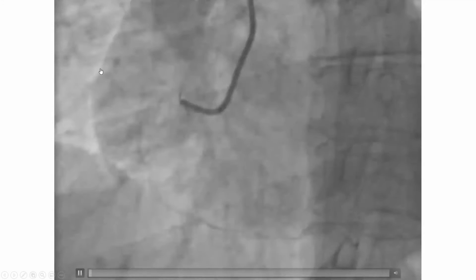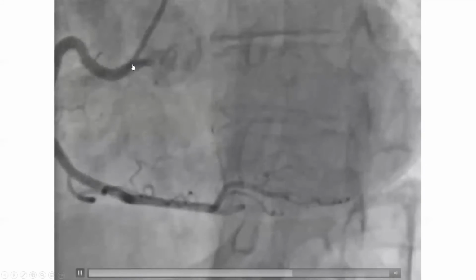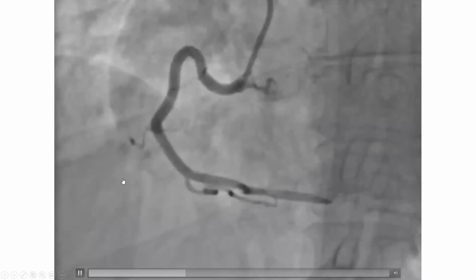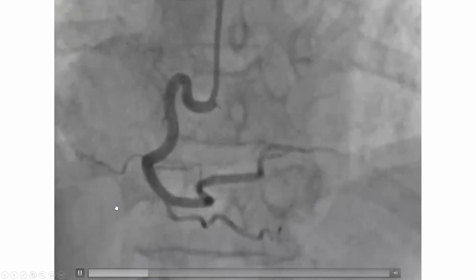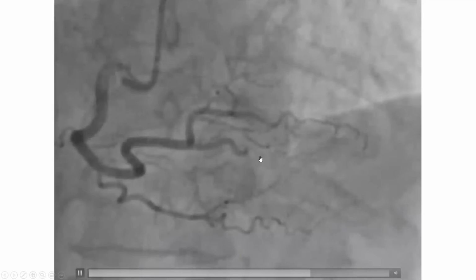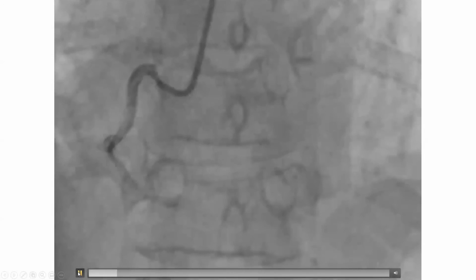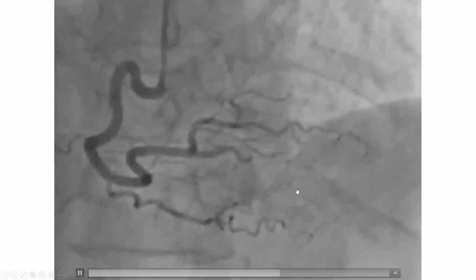It's not just that the catheter may dissect it. It's just that the artery may dissect itself with every movement. And the catheter is making it more likely here with every injection. And look at this. I mentioned, look at the PDA. It's occluded. And I mentioned multivessel SCAD is seen in 10 to 20% of patients. Actually, more so in pregnancy. It's up to 30% of pregnancy SCAD. So this patient had multivessel SCAD.